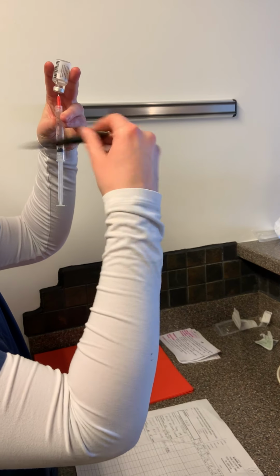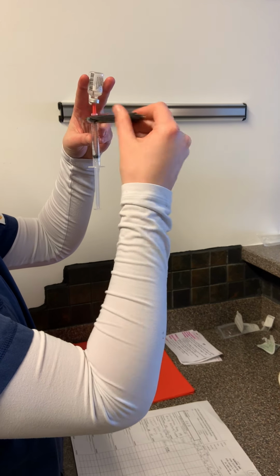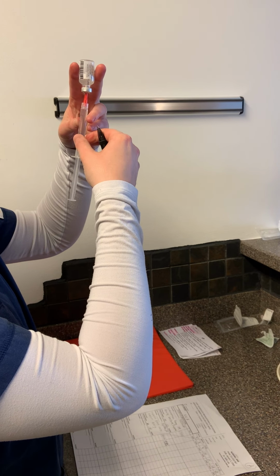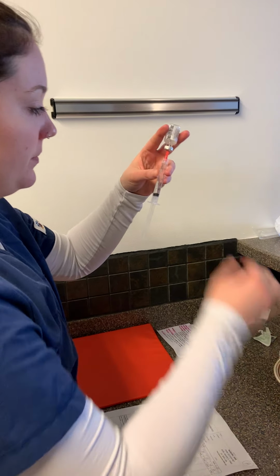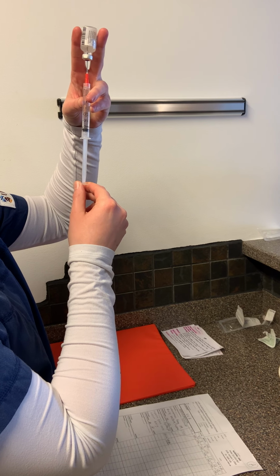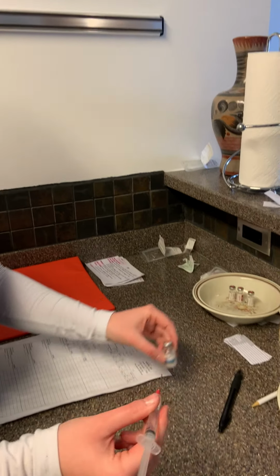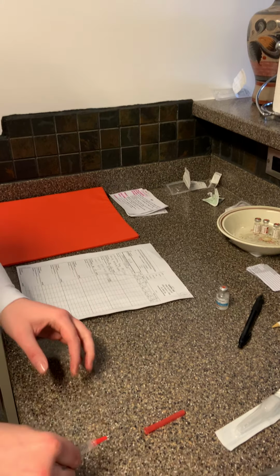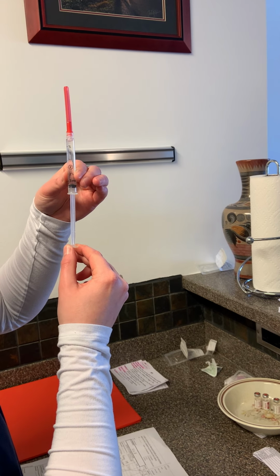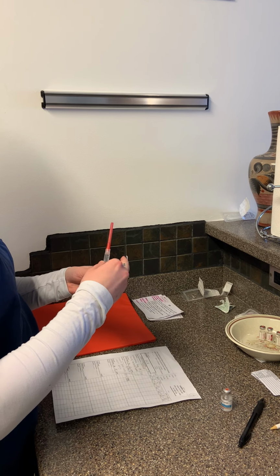Okay, I'm just going to knock out the bubbles, and then I'm just going to withdraw a little extra just to waste after I've put on the IM needle. So I'm just going to use the scoop method, scoop it. Then I'm going to pull back to make sure that all the medication is in the syringe. And I'm going to prepare my IM needle.